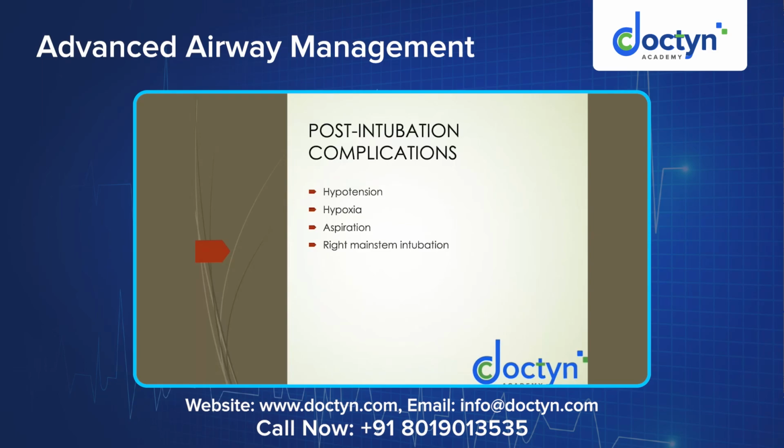Intubation complications, they said, are hypotension, hypoxia, aspiration. So now why does aspiration occur? During bag mask ventilation, we would have ventilated for quite enough time to maintain oxygenation. The air not only going into the trachea would have gotten insufflated into the stomach. Once you try laryngoscopy, and you usually give a relaxant for intubation, it also relaxes your esophageal sphincters, which leads the gastric content to get regurgitated into the oral cavity.